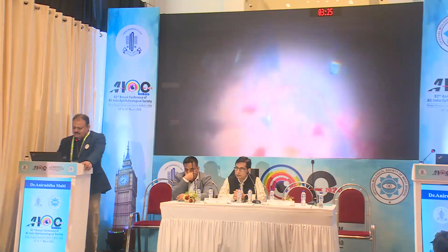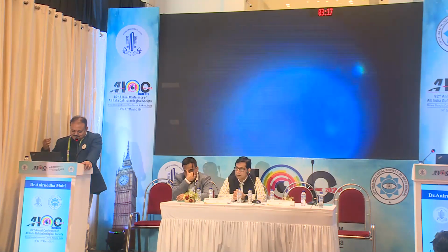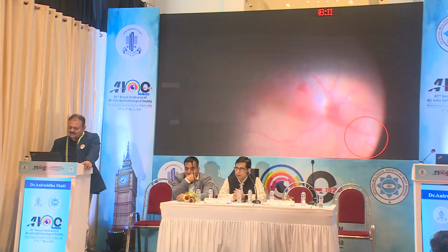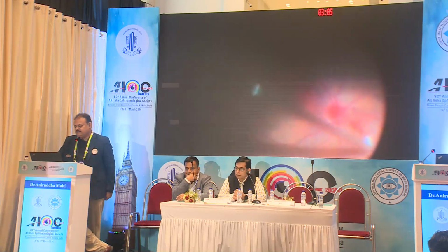And this is an unusual case. There was a touch by the soft tip because we were pushing the PFCL and the assistant was new, and we pushed it hard and the soft tip actually went inside and hit the retina.